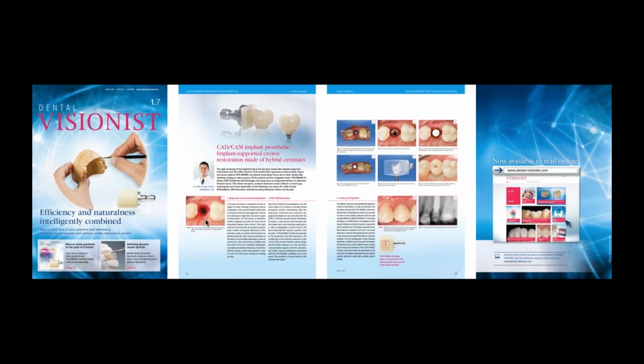As you can see here in this photo, immediately after removing the provisional or your custom healing abutment or your conventional healing abutment, we will go ahead and scan the soft tissue. And in this first scan, that's where I will be scanning the interproximal areas of the neighbor teeth, okay? Sometimes we need to analyze to see if we don't have any angulation of those neighbor teeth, because sometimes we need to make a small recontouring on the proximal surface to be able to achieve an ideal interproximal contact area, okay? Sometimes we don't analyze this, and when we're in the design phase, then it's very challenging to create an ideal contact area there. So sometimes I use a red line, fine diamond burr, recontour the proximal a little bit, or a SofLex disc, and go ahead and scan this, okay?